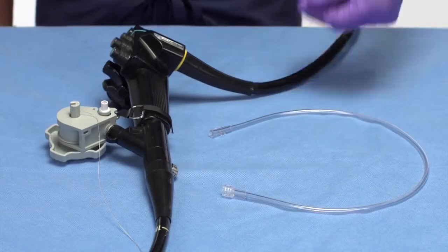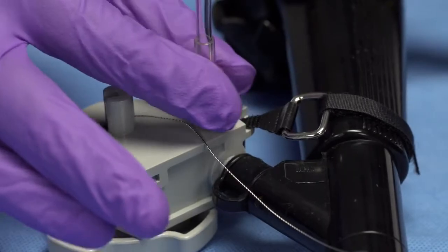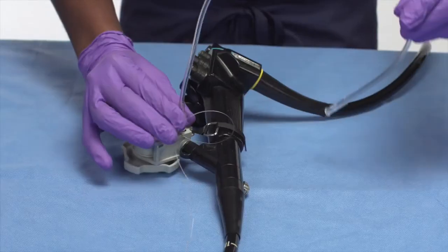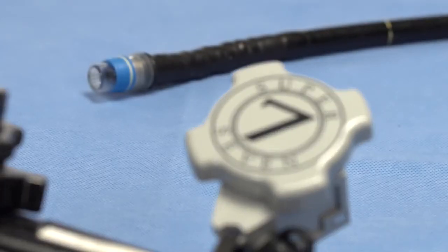For irrigation, attach a syringe or the irrigation tube provided to lure fitting on the irrigation valve. The SpeedBand SuperView Super7 device is now ready for use.